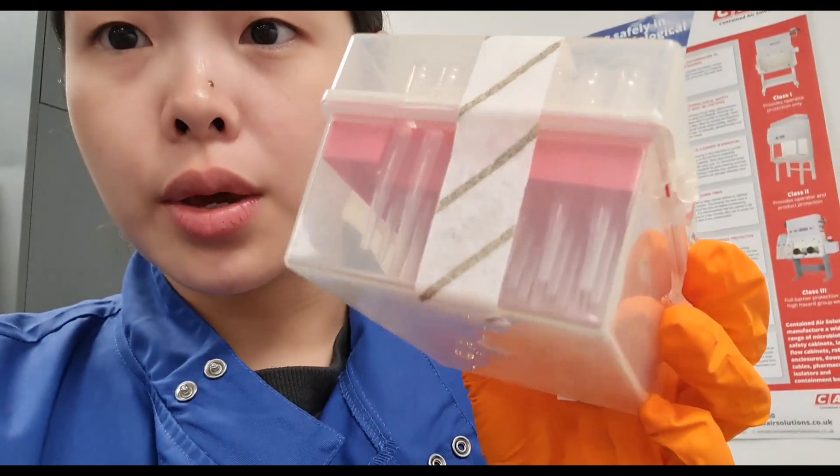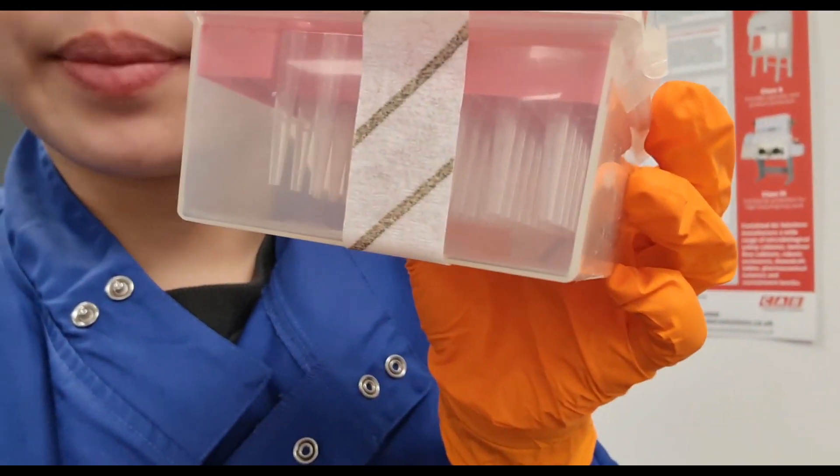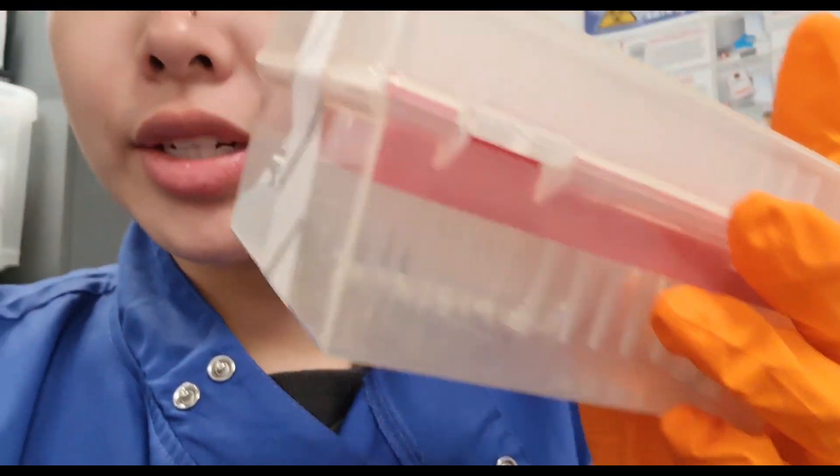I use these wide-bore tips. You can see that at the bottom it's wider and less sharp compared to the regular tips, and that's because we don't really want to scratch the surface of these ESLs. These are also autoclaved just to make sure there's no contamination.